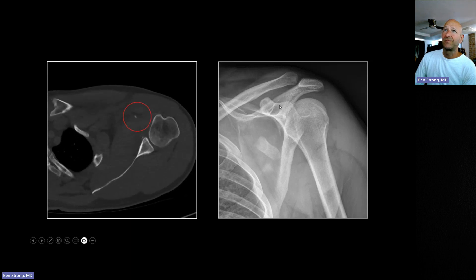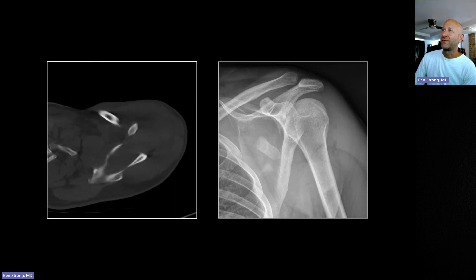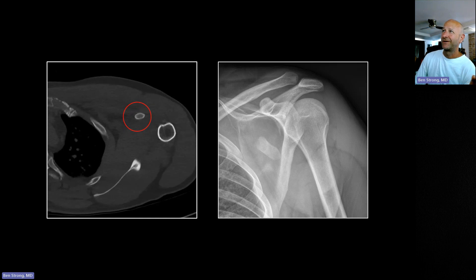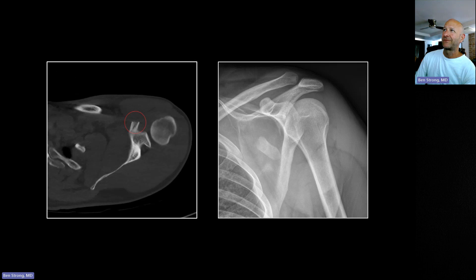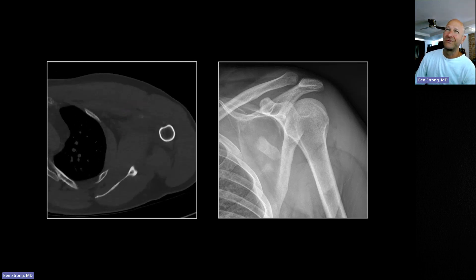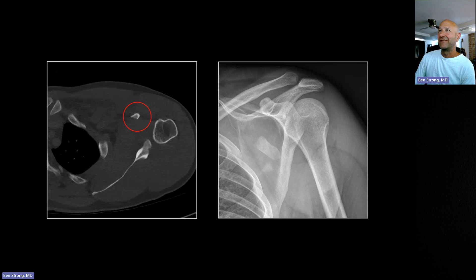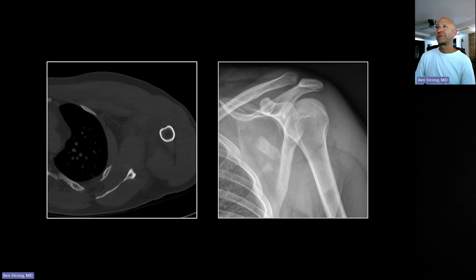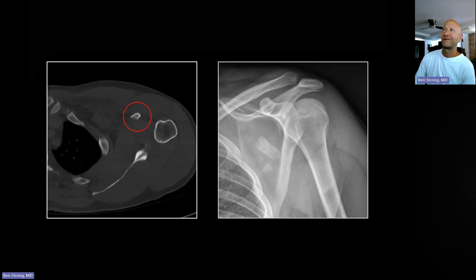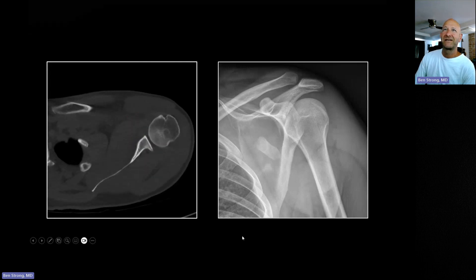There is incidentally a growth plate at the base of the coracoid. One of our first-year residents looked at a chest CT on a 13-14 year old trauma patient and called bilateral fractures at the base of the coracoid process because he didn't know there was a growth plate there. Not only did he believe bilateral coracoid fractures were possible in the same patient, he called it on two consecutive CT scans — apparently thinking it was common.